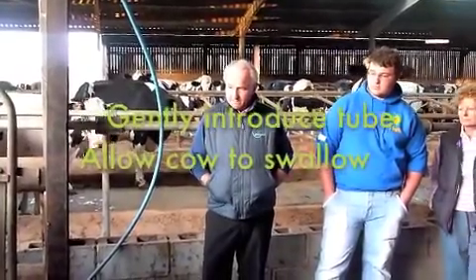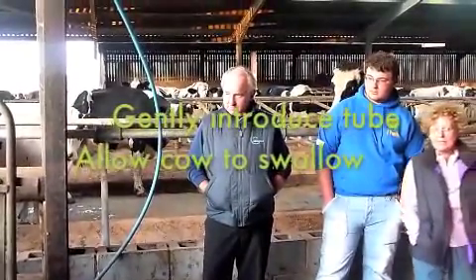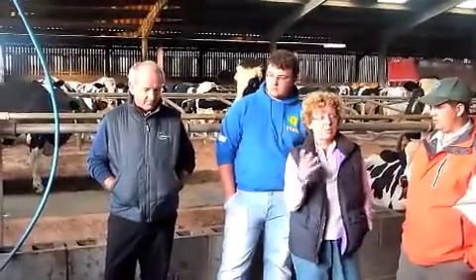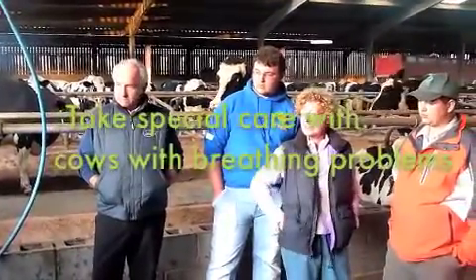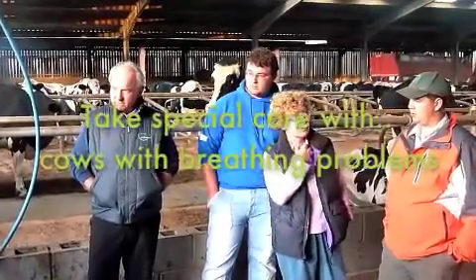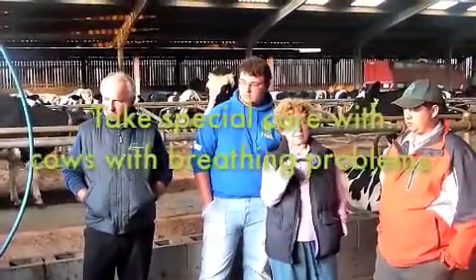You've got to be a little bit careful with cows that are really sick — cows that are flat out. Perhaps a cow with ketosis: she's nervous and perhaps not swallowing as well as she normally would. So you've got to be a little bit careful with those who aren't swallowing very well. Very good point.